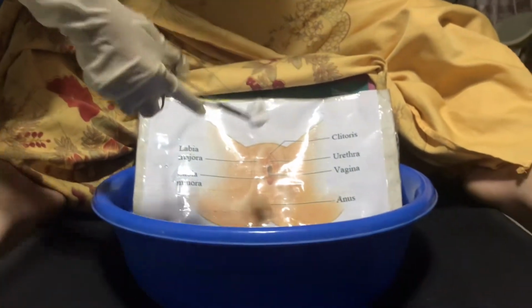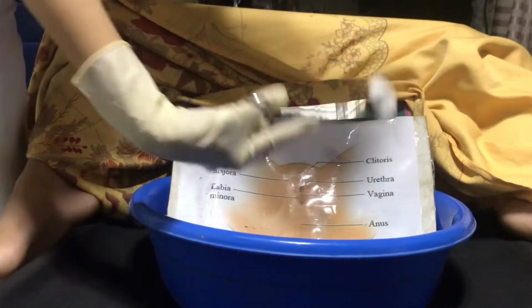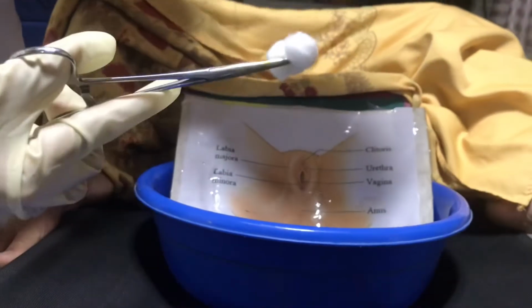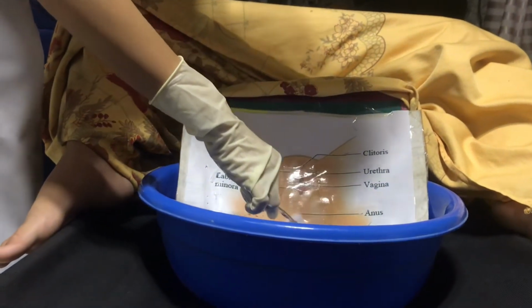Third cotton ball, same, and discard. The fourth one, and discard. Then the other side, then down to the anus, then discard.